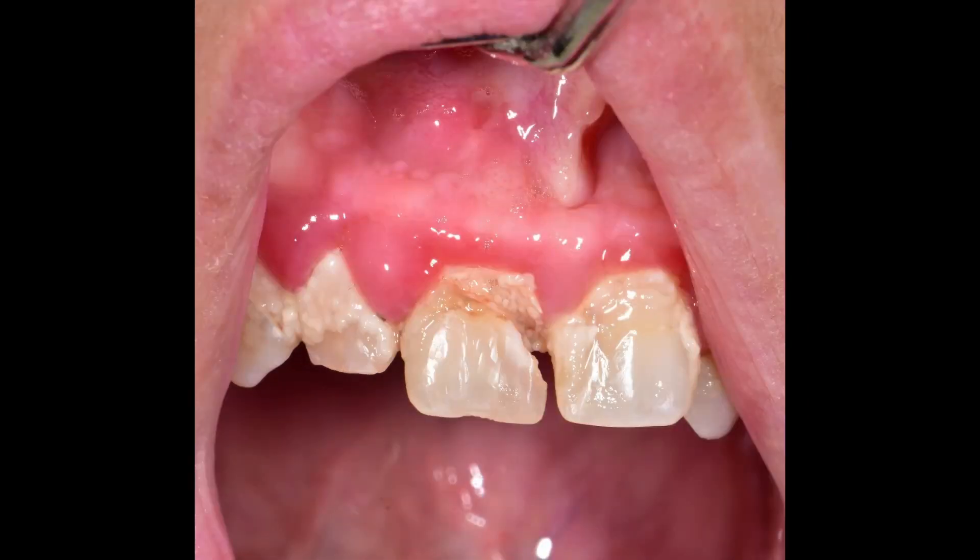As you can see there's a large cavity, lots of plaque on the teeth, lots of inflammation in the gums. Here's an x-ray showing the tooth. You can see the dark spot at the end of the root tip, and that's what an infected tooth looks like on an x-ray.